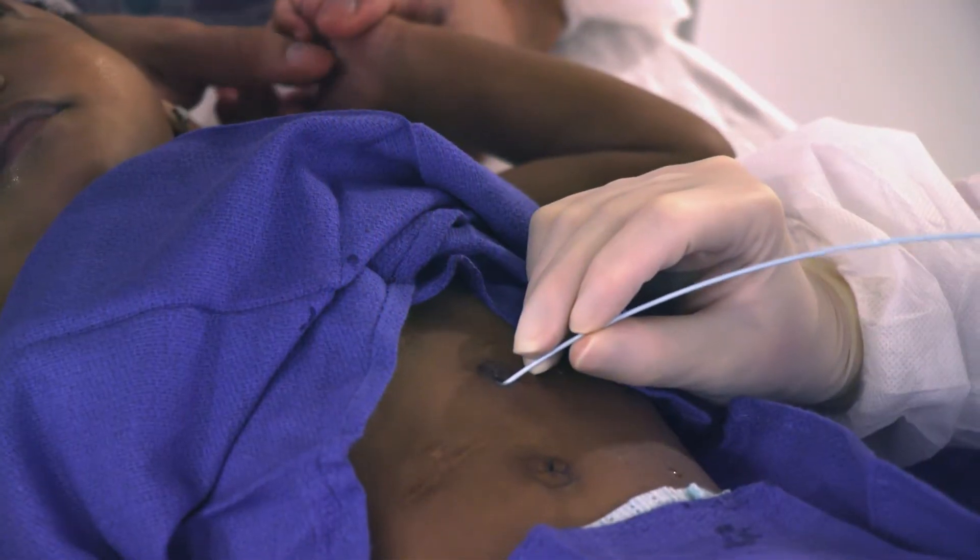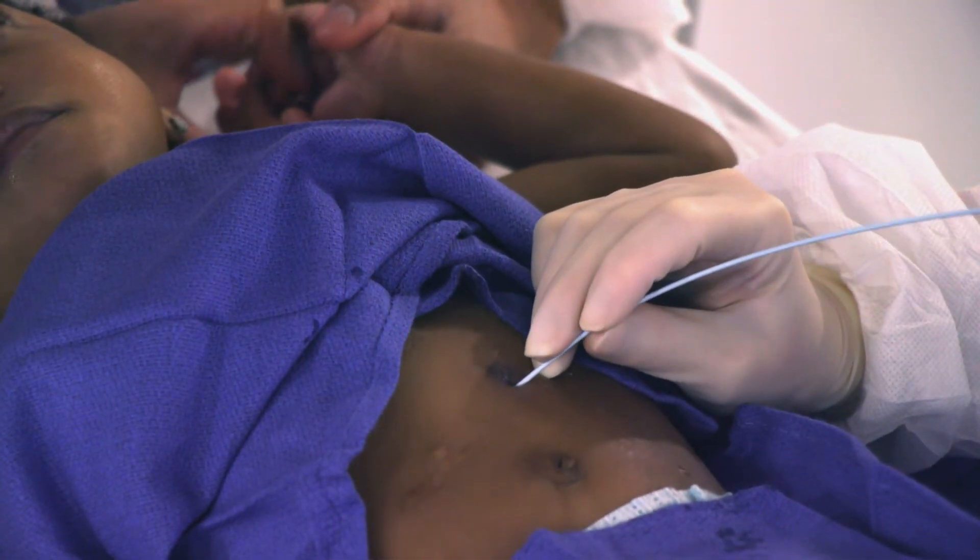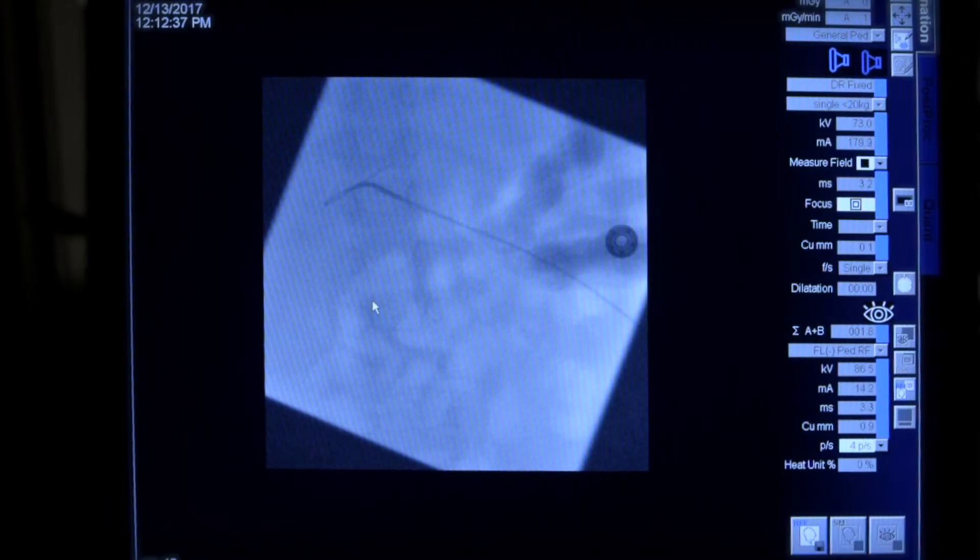If that doesn't work, then what I'll do is get a directional catheter, which is what I did in this case. I was having trouble crossing the pylorus with the tube itself, so I used a directional catheter — in this situation, a Berenstein. You could also use a Compy or a JB-1, whatever you're comfortable with. With that, I can direct the guide wire a little bit better and get across the pylorus into the small bowel.